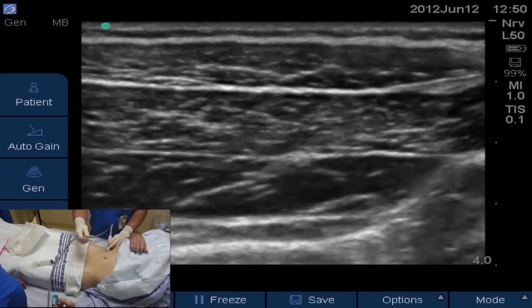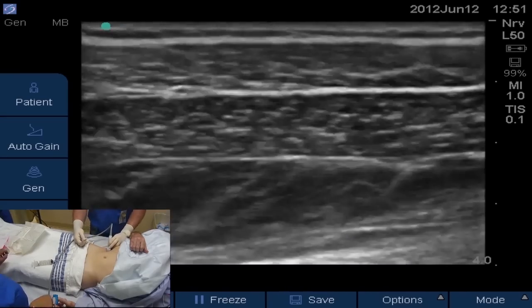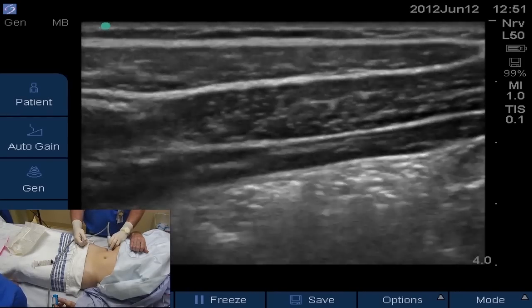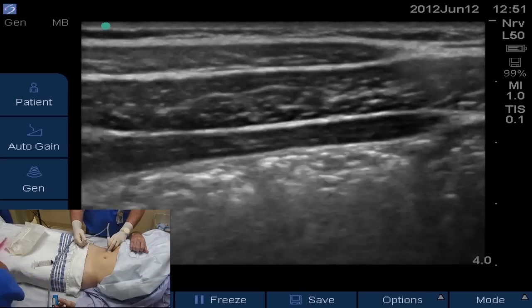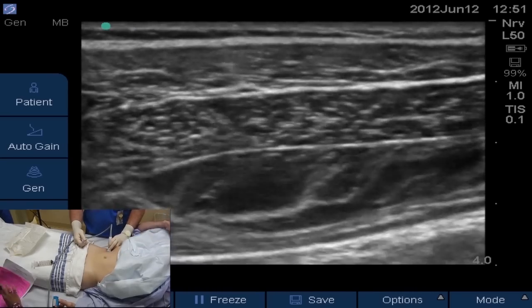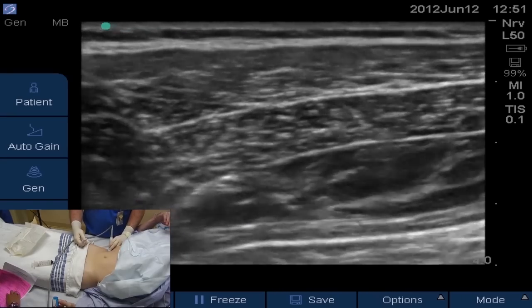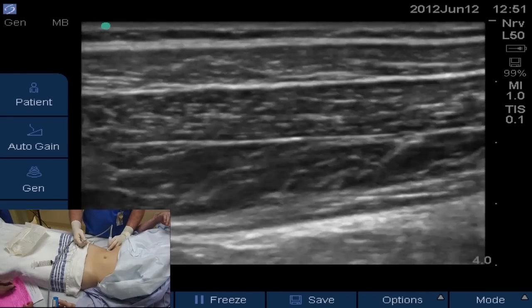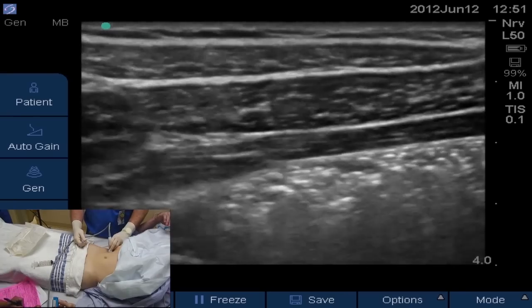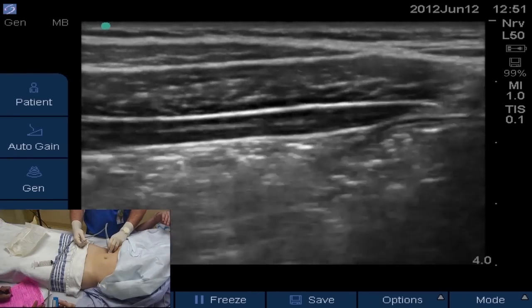Here we are pulling our needle back out. We've finished. We've opened up our plane and are going to have a successful block. The whole TAP plane is opened up with local anesthetic. This is a high-volume procedure — it works best with high volumes. We use 30 to 40 cc's. If you get that volume posteriorly in the TAP plane, it allows the local to spread across the dermatomes of nerves T7 to L2, giving you a broader block as more nerves come through the TAP plane.